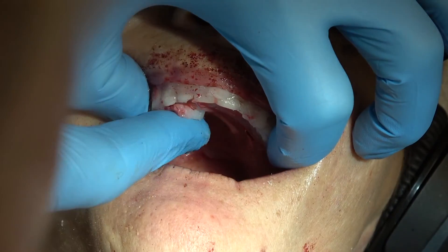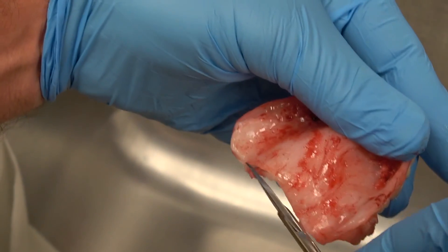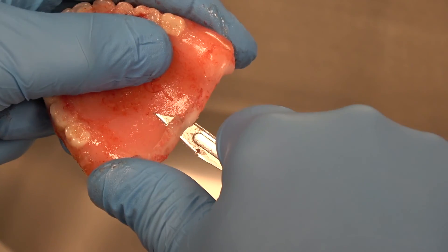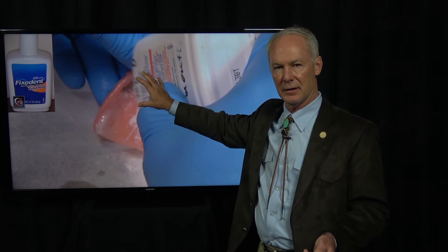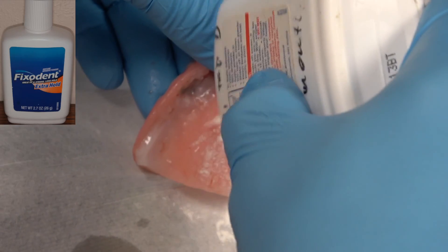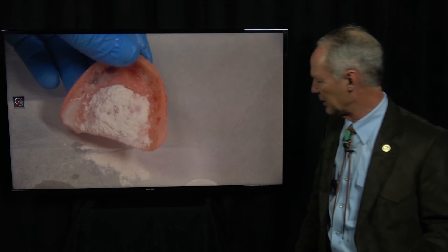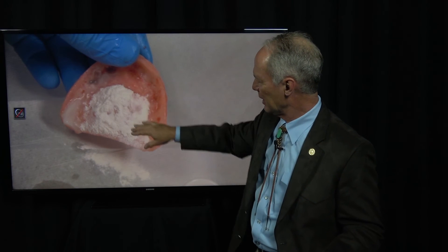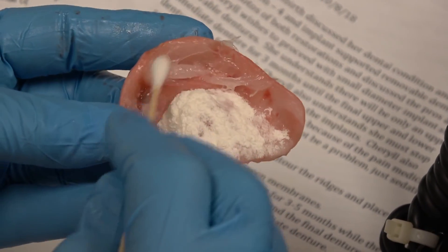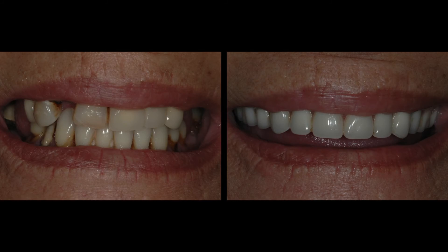Take your finger and just wipe off a lot of that excess Line-All that's come through the holes on the palatal side, then trim that off — it's real easy to trim. This is Fixodent. Now you wet the denture, wet the liner material, and have the patient swish water around in their mouth. You want the denture wet and the patient's mouth wet. Then put this just on the palatal part — don't put it up where the implants are — tap it on a piece of paper to get that excess off. Don't tap this down the sink or you'll plug your sink up. Then apply your neosporin ointment, push it to place, and there you have it.